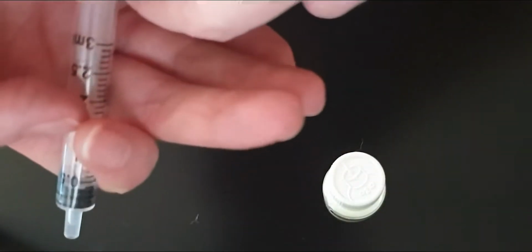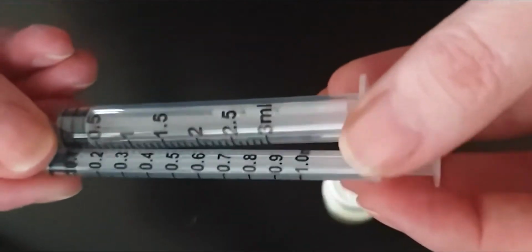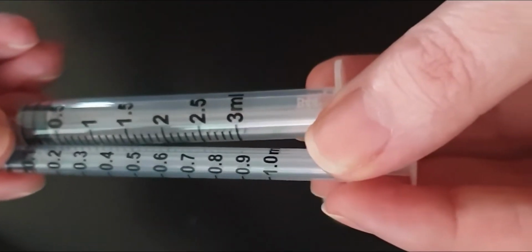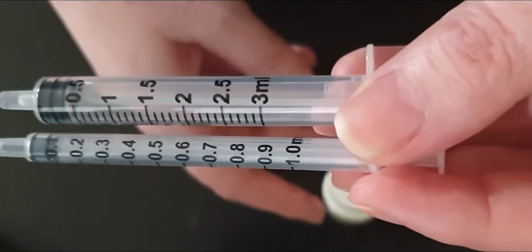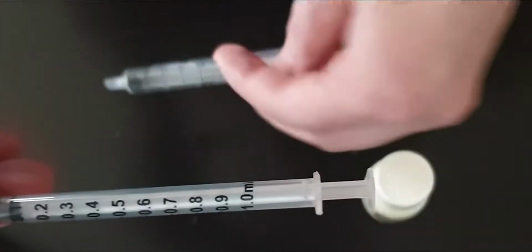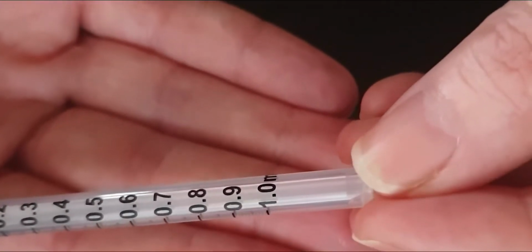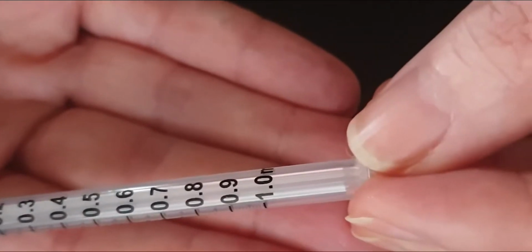An easy way to remember how much you need to give is to think about mils as you would about dollars and cents. So you know how much a dollar is, and you know how much 50 cents is, you know how much 10 cents is, you know how much 5 cents is. Think about 1 mil as being $1. So this whole syringe is $1. So you've got 1 and a decimal place and zeros afterwards.